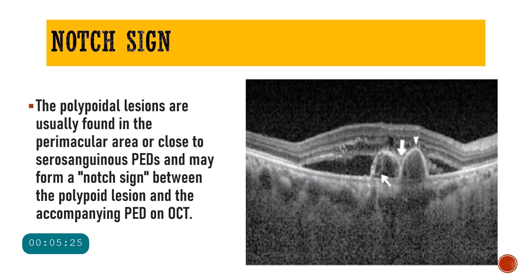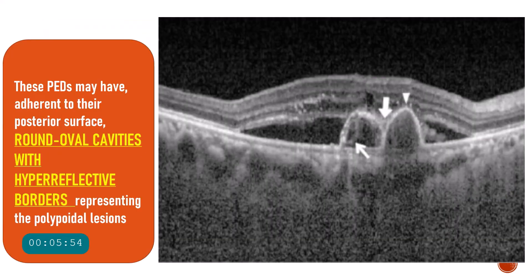Another sign seen in polypoidal choroidal vasculopathy is the notch sign. The polyp lesions are usually found in the perimacular area or close to the serosanguinous PED. You have one larger pigment epithelial detachment and adjacent to that the polypoidal lesions — usually there will be a notch between these two lesions. The presence of this notch can indicate polypoidal choroidal vasculopathy, and this is called the notch sign.